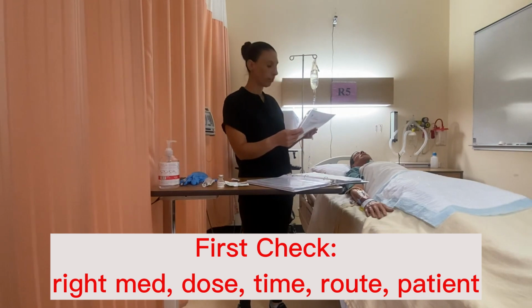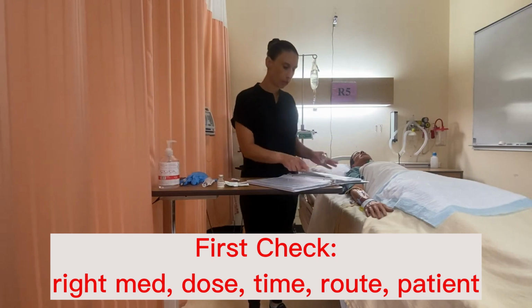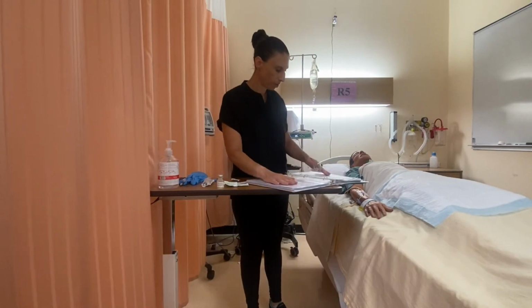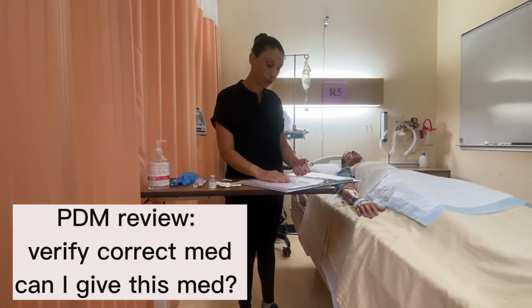It has not been given. It's IV. It is due now. And it's for Parsio Parsons. So just verifying meropenem. Yes, yes. Okay. I'm looking at the correct PDM and I can give it as a student nurse.